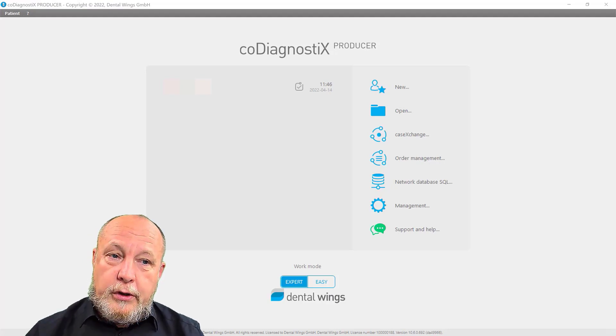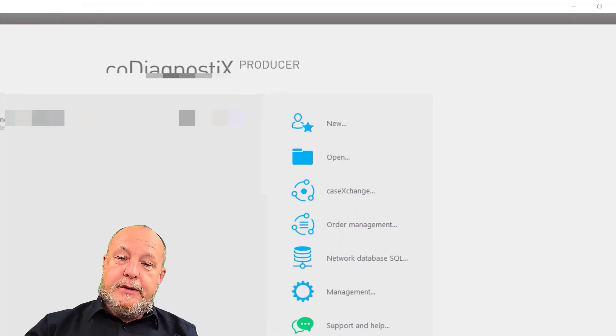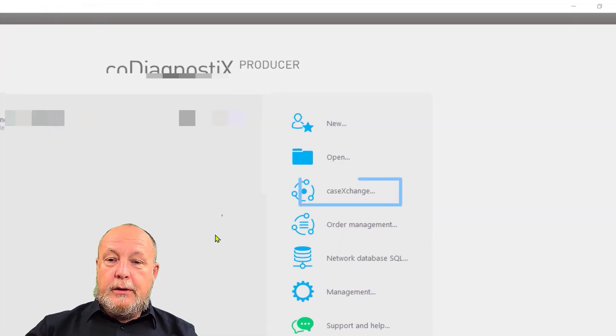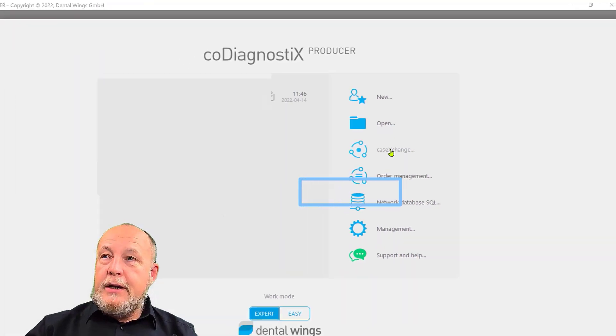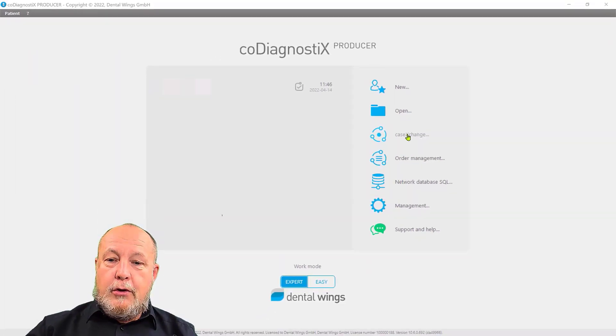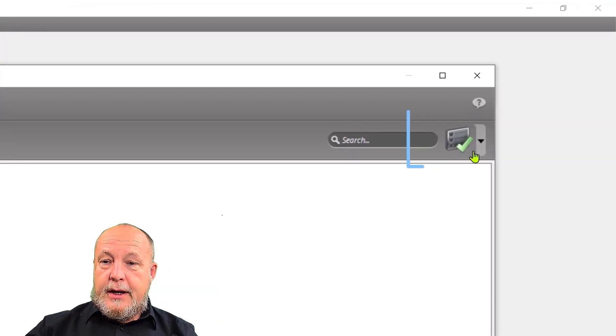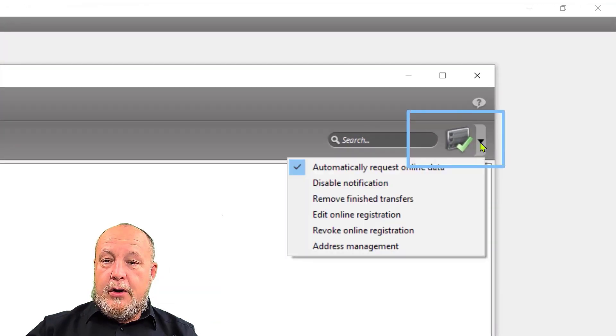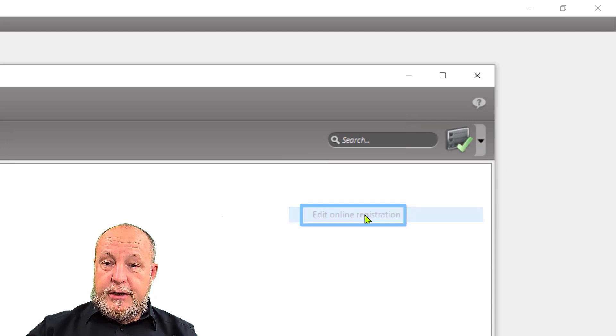But what if you did not store it? There is a small possibility to find it on your old computer. Go on case exchange, then here go on edit online registration.